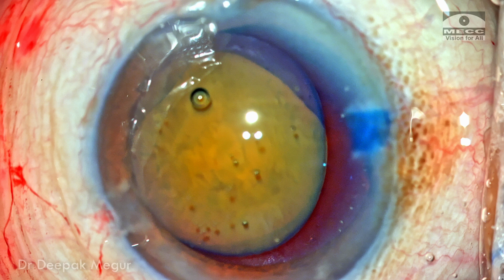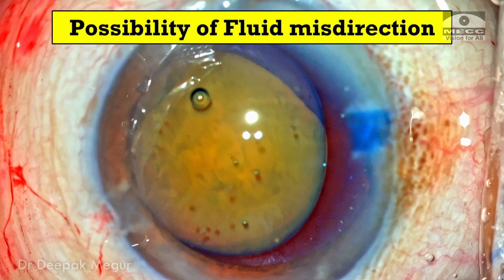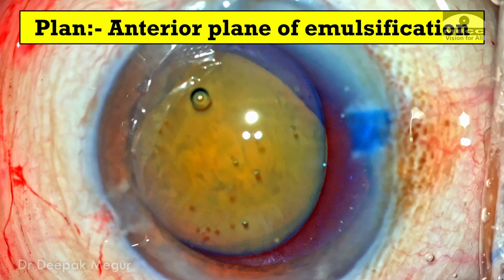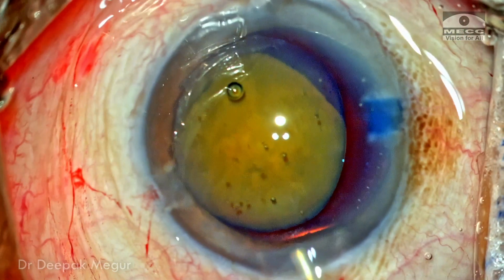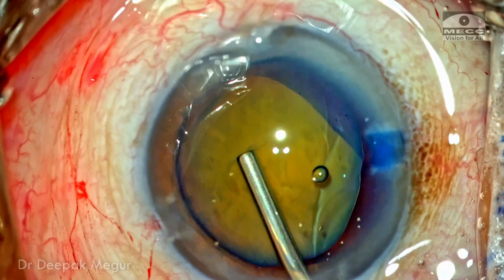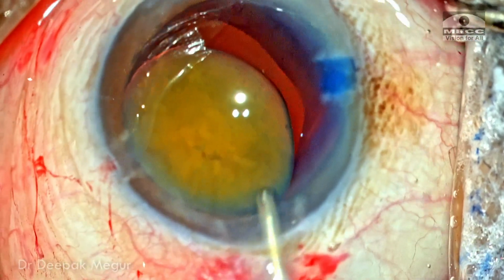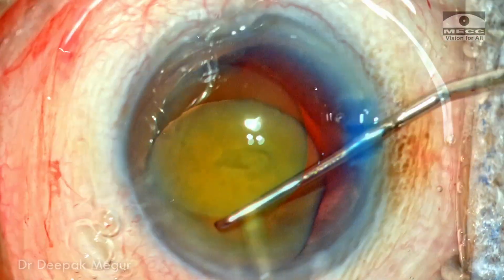Now, because the bag is very empty and I am going to expect some amount of positive pressure because of a possibility of posterior fluid misdirection, even with the usage of CTR, I'm going to perform an anterior plane emulsification. The dispersive OVD is used to tamponade the area of zonular weakness and prevent the fluid from migrating into the posterior chamber, and HPMC is used above it.